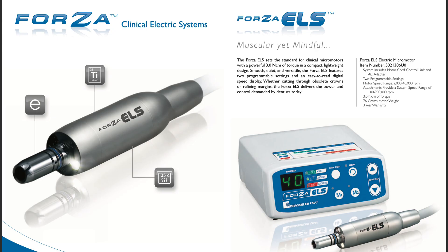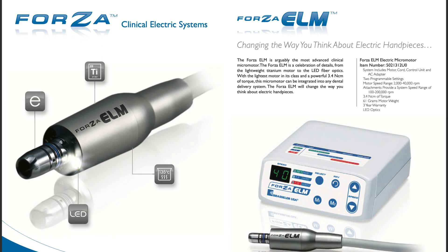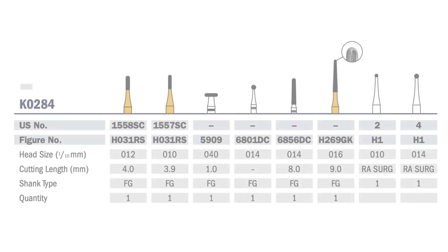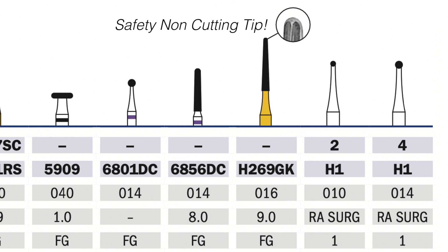Having a powerful electric handpiece like the Forza electric handpieces is a very helpful complement to these burrs. The H.269GK is a general-purpose carbide burr — like the LN or the EZ burr — that, like the long dura-cut diamond burr, helps refine the axis in non-crowned teeth in order to achieve straight-line access.